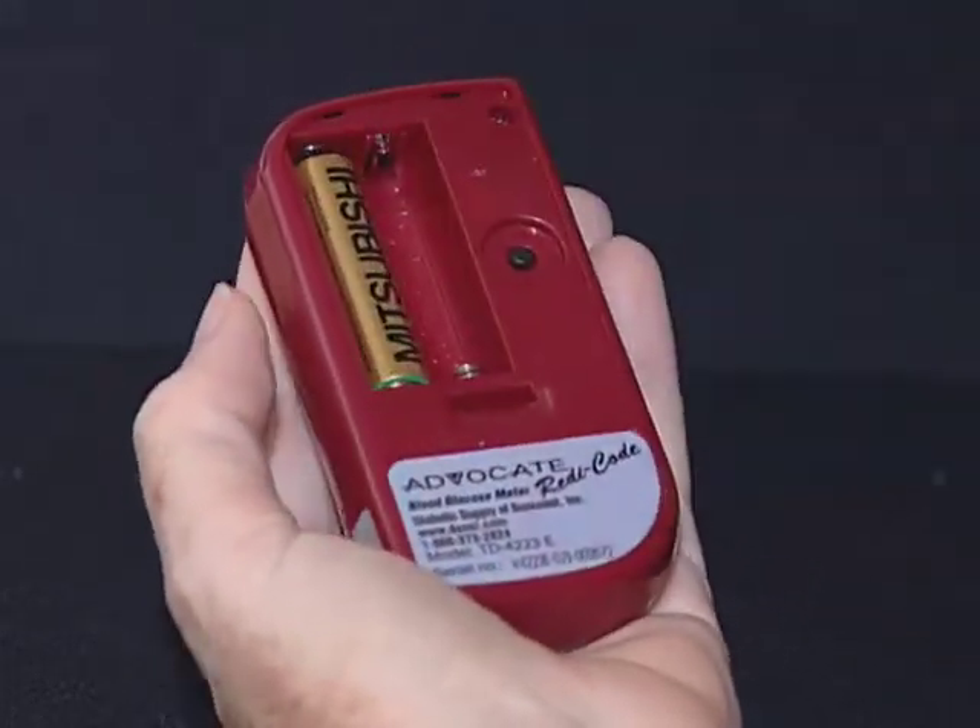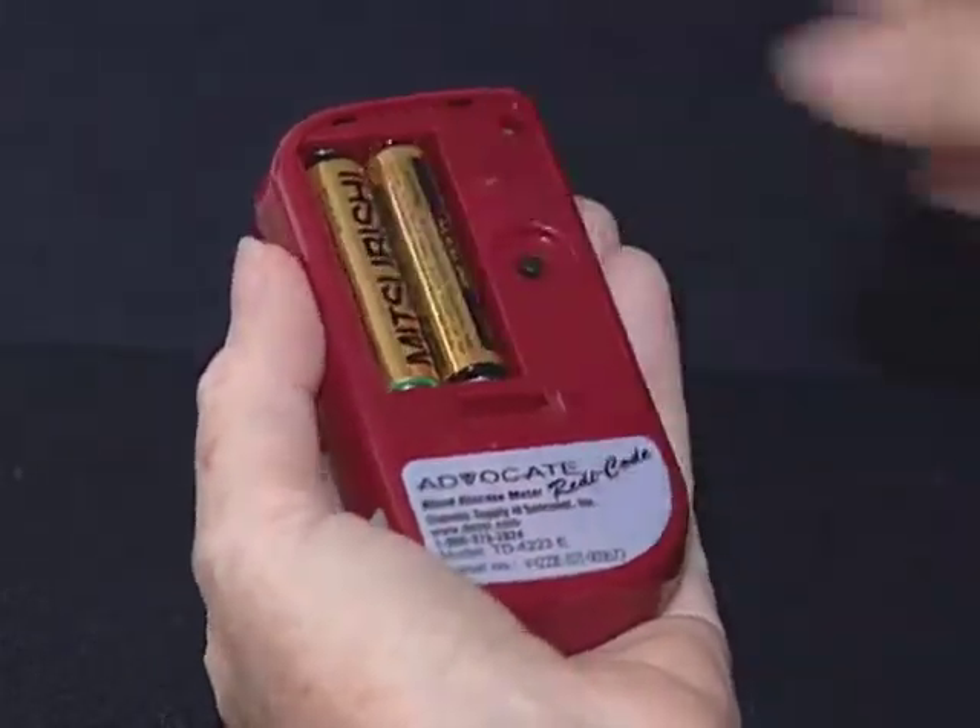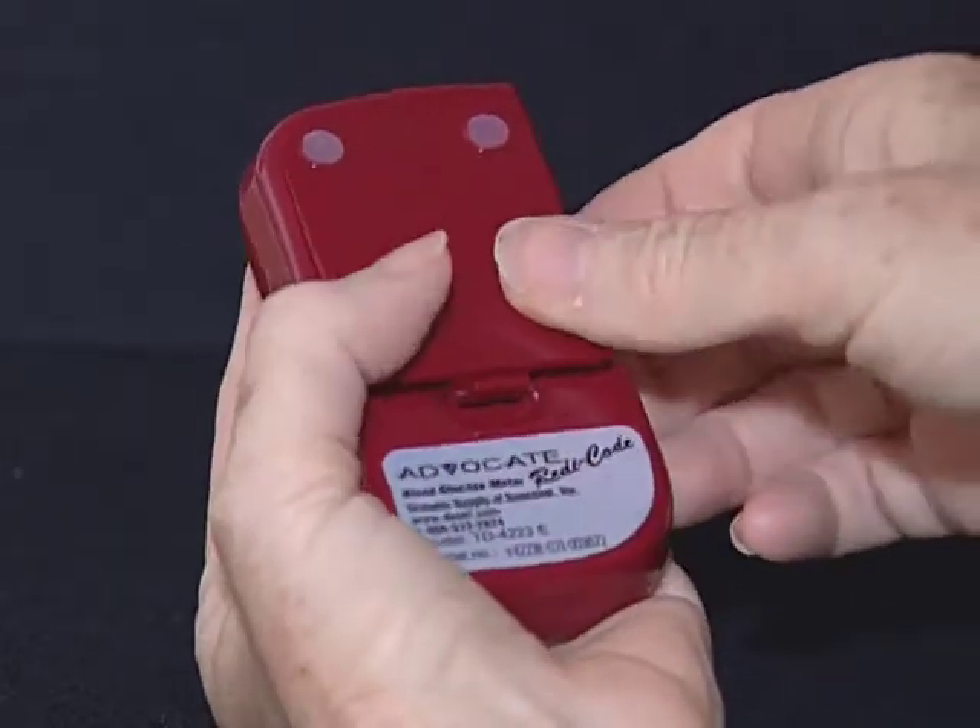If the batteries are inserted correctly, you will hear a beep. Close the battery cover.